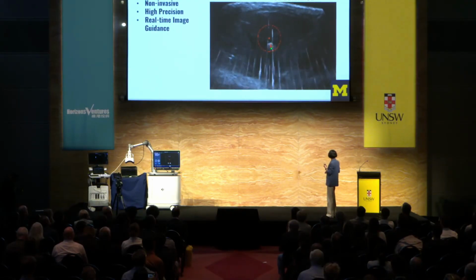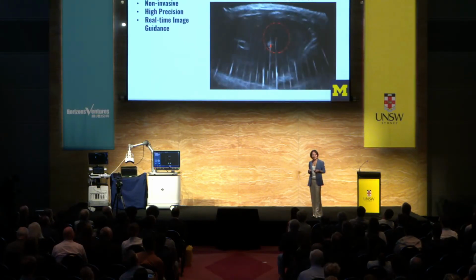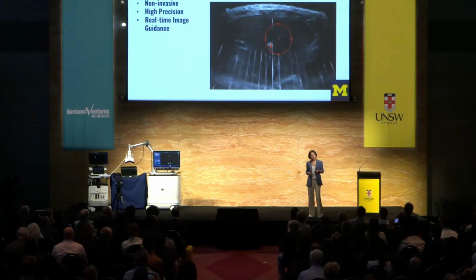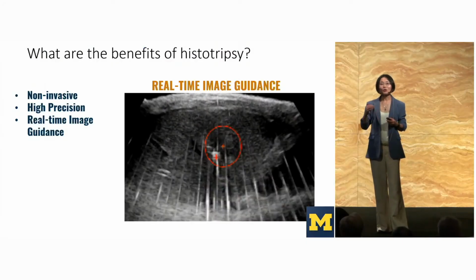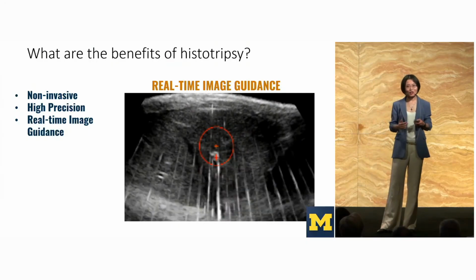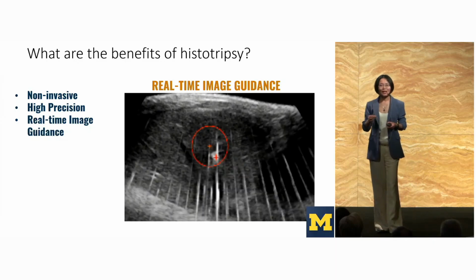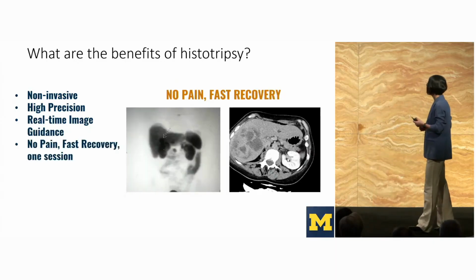And see the bright spot here behind the red cross? That is a bubble cloud, a cloud of bubbles generated by histotripsy. The bubbles are a natural contrast agent for ultrasound. Therefore, you can see the bubbles generated in real time. That helps the clinician guide and monitor the treatment, even without opening the patient up, to maintain high safety and treatment accuracy.